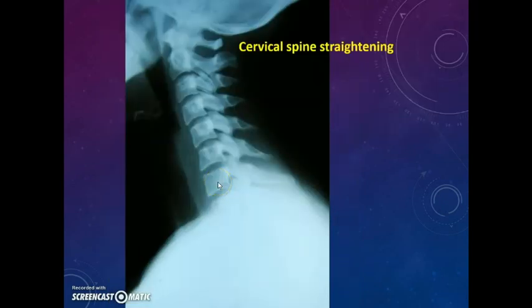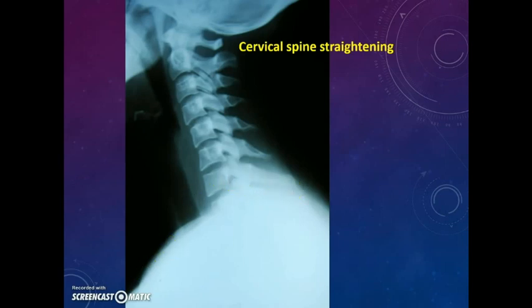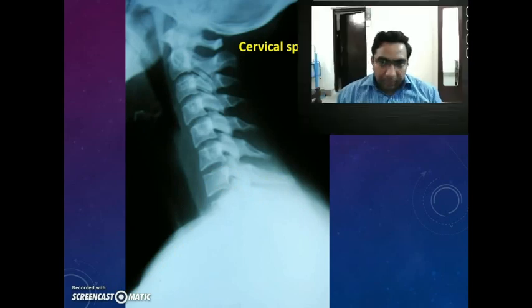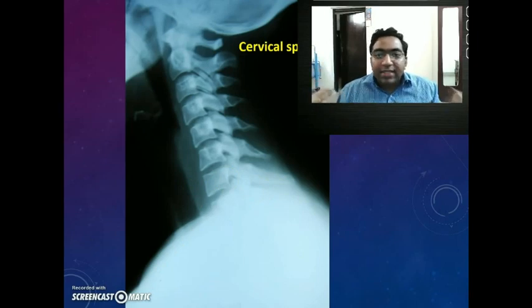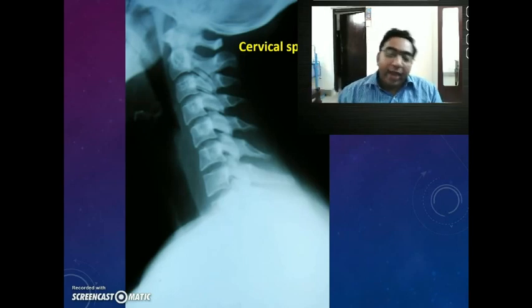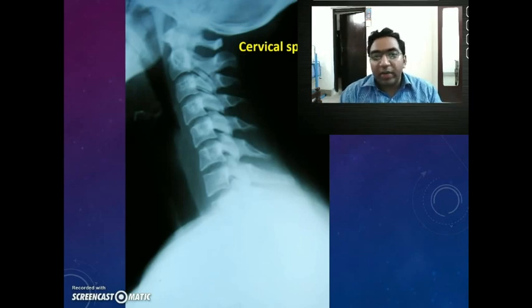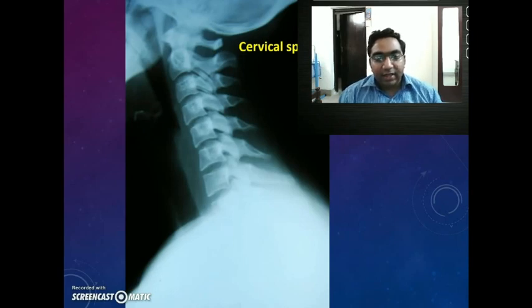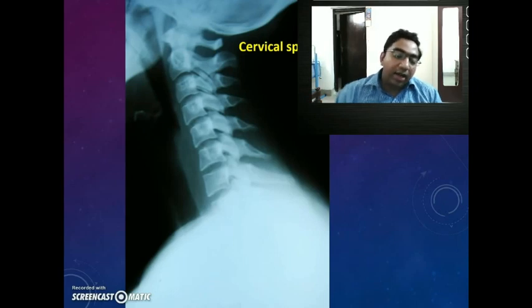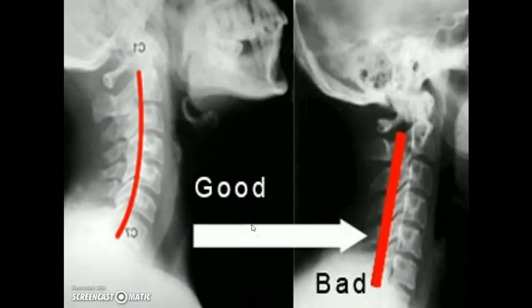This is a case of cervical spine straightening — we are not seeing the curvature at all. We can see all three lines — the anterior vertebral line, the posterior vertebral body line, and the spinal line — all straightened. When all three are straightened, there is some sort of cervical injury. This happens because when there is trauma to the neck, the muscles around the involved joint go into spasm, and the inherent tone that maintains the curvature is disrupted. When we see straightening, there is some sort of cervical spine injury.